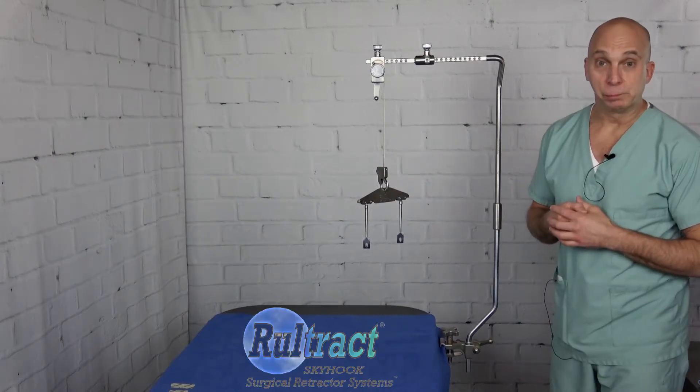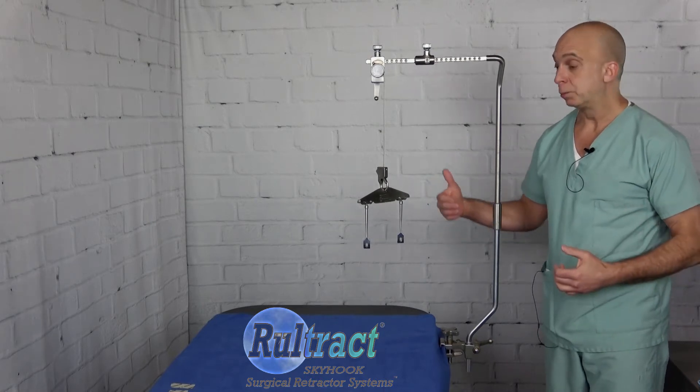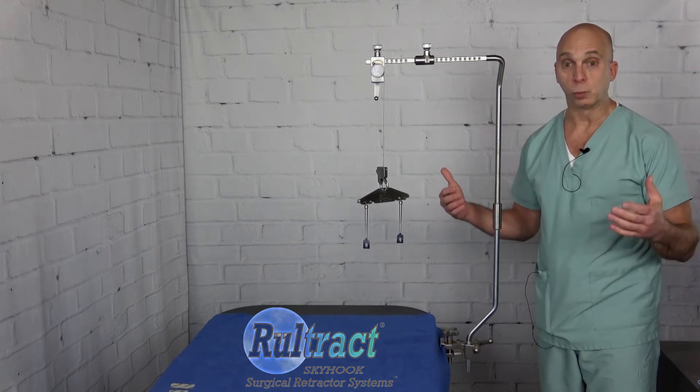Hello Phil and the rest of our friends at Maine Medical Center in Portland, Maine. My name is Philip Rouleau with Rultract. This is the obese patient design Rultract retractor we spoke of. I'm going to go through very quickly how to set this equipment up because it is a little bit different than what you're used to.